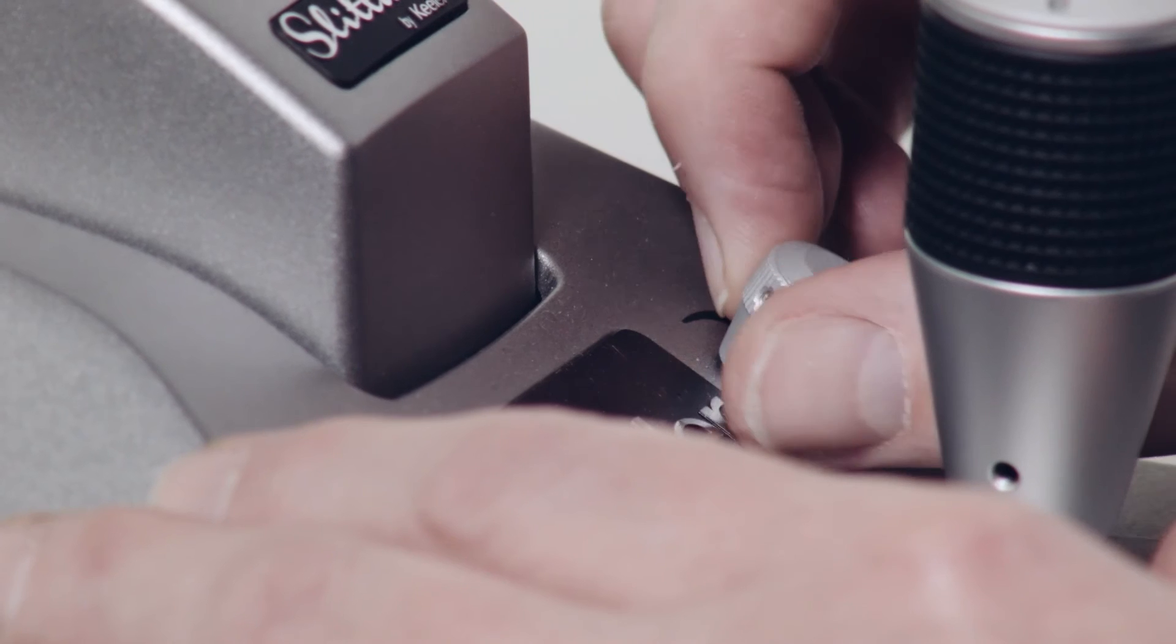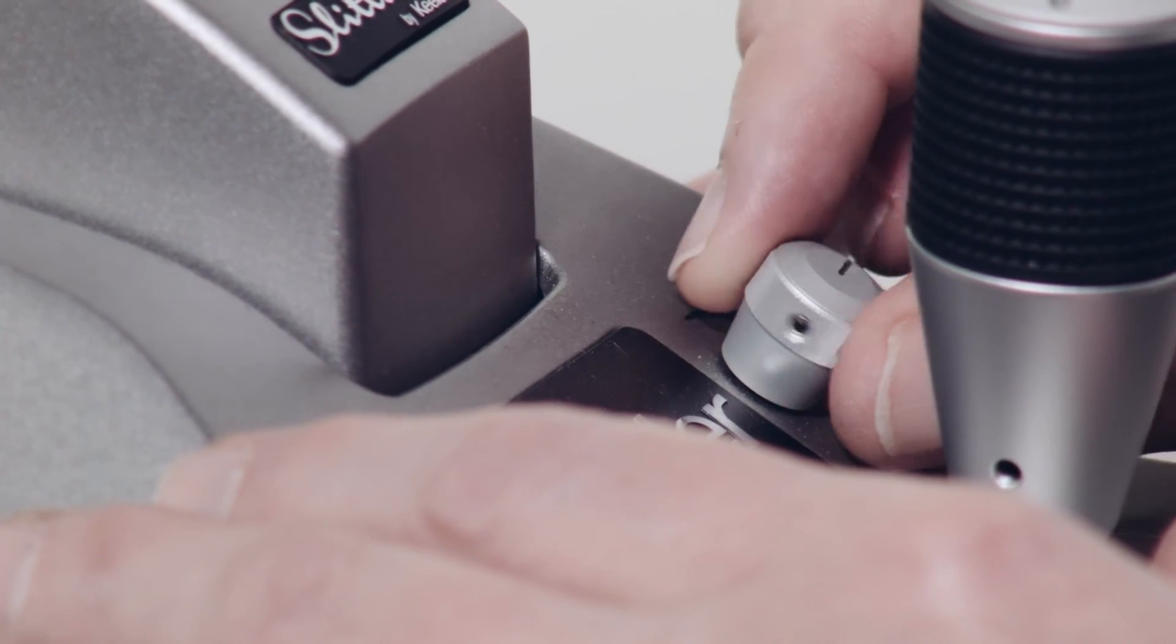When examination is complete, set the rheostat low and switch off the slit lamp.